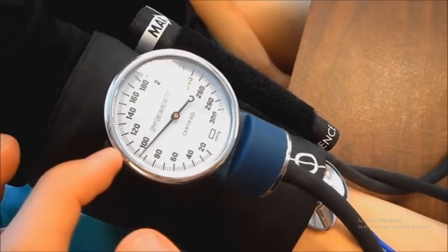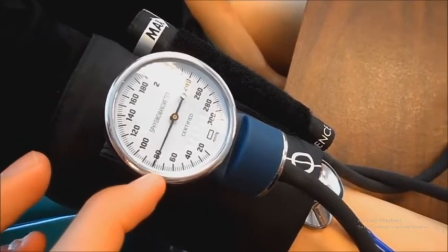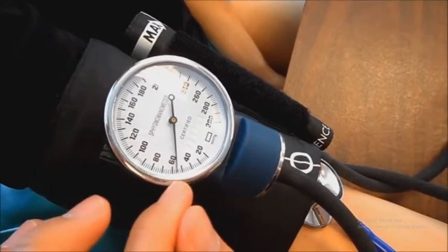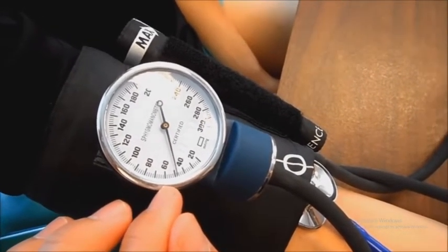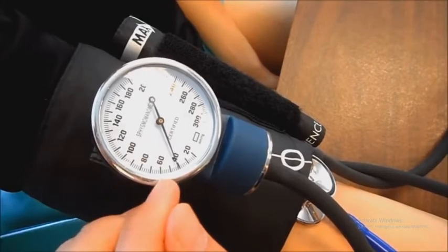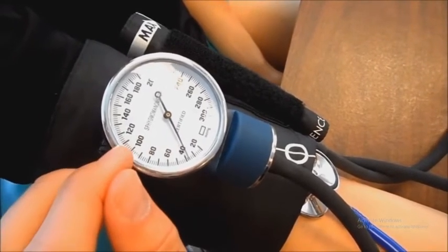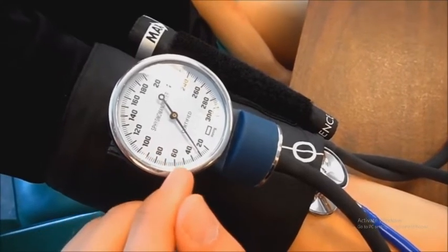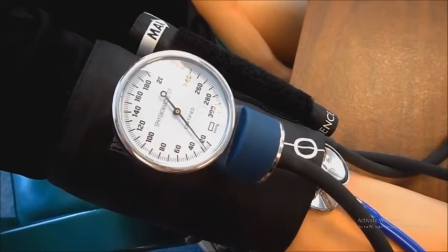And that's where I heard my first thump, and you can see the dial bouncing up and down. The last thump I heard was at about 64. So I got about 118 over 64, because that's where I heard my first thump, heard more, watched the dial bounce up and down, and at about 64, I didn't hear anything anymore.